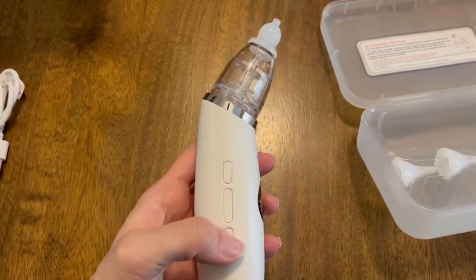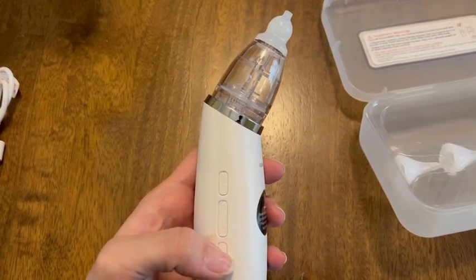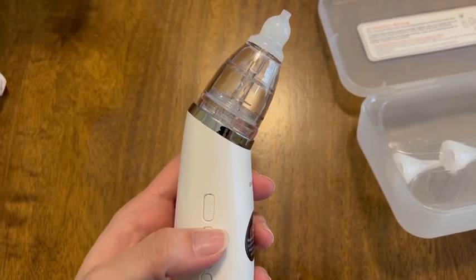It has a few different modes. You're able to choose between weak, moderate, and strong suction modes. In addition to the different suction modes, you're also able to play some music, and you have different light modes.